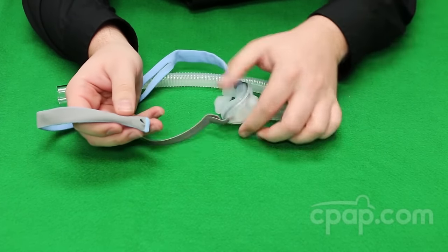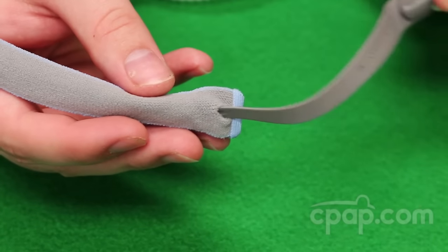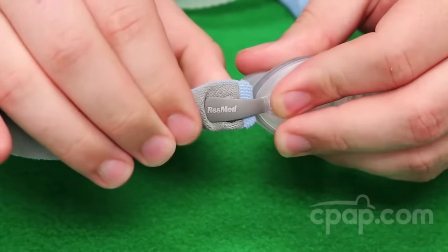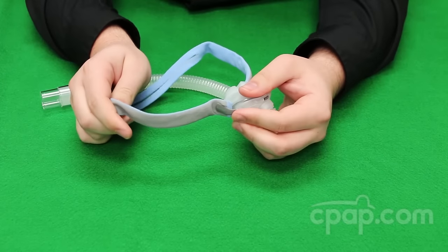To reattach the headgear, simply slide the stabilizer back into the buttonhole and then pull the fabric end over the stabilizer base, and repeat with the other side.